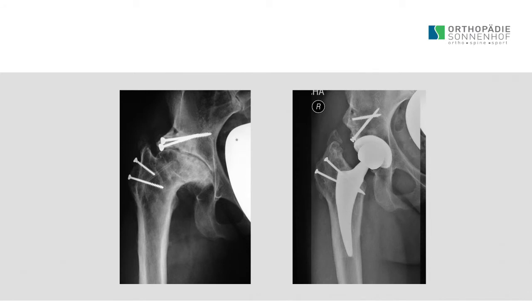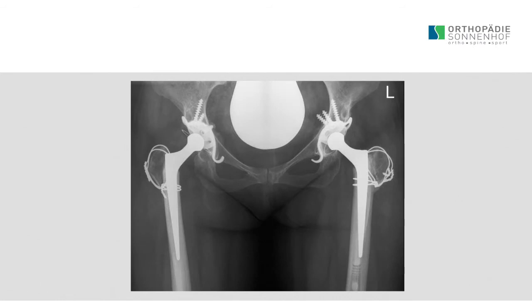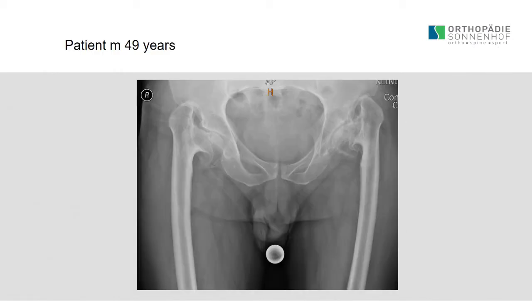And this is 6 years down the road. So you have an autograft that is completely healed in, and you have plus minus a primary hip, as you would look for in a primary fixation. These are cases that are much more difficult, just dealing with the leg lengths. In earlier days, we used cemented ones, and we did the shortening, especially in the metaphyseal area. These are, as I already said, cemented ones, and we distalize the trochanters on both sides. This is a very difficult case, as you can see, with this very high riding trochanter.